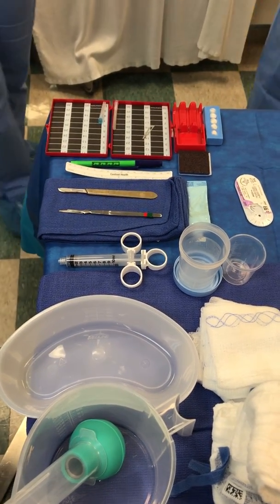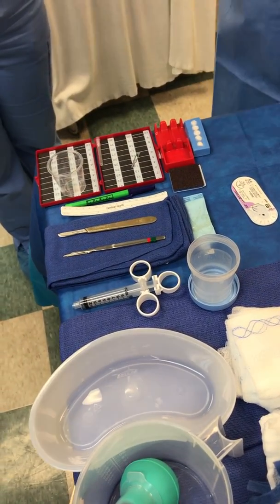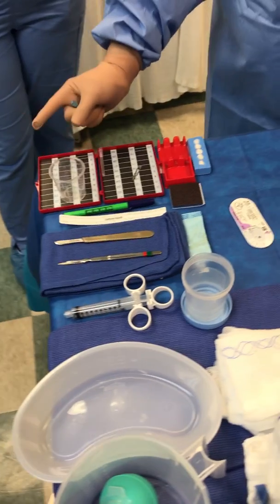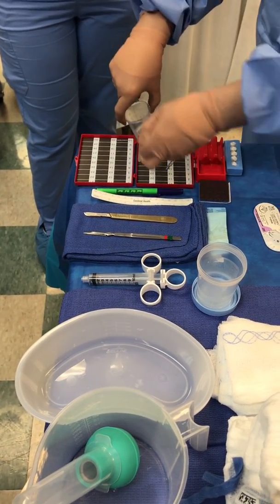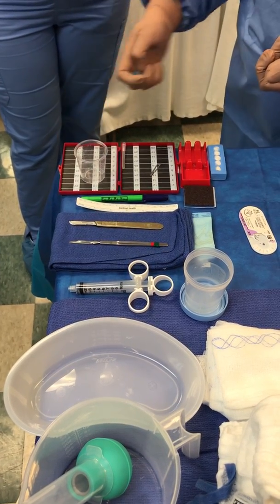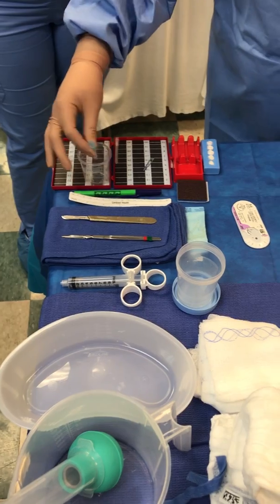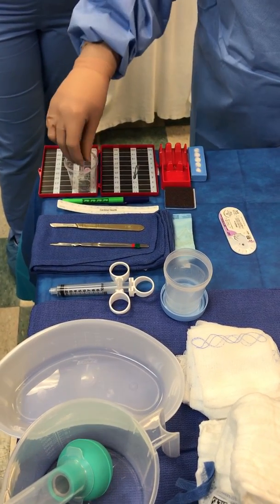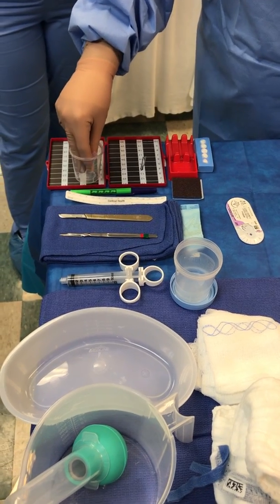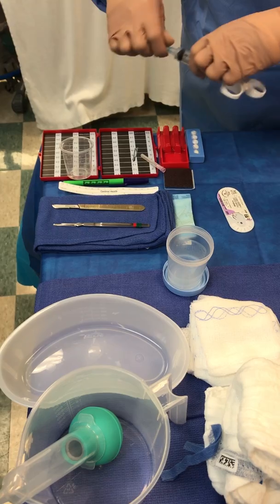And actually, on my actual setup, I put this here because my thing is deeper, so I put that there because if this spills, it's in there. I could always go like that and scoop it up and save it. And I have two of these, so I put my sharps in one, and the other one I put the medicine. And I'm always ready with my syringe and my medicine.